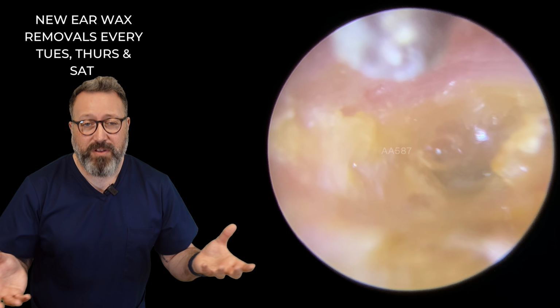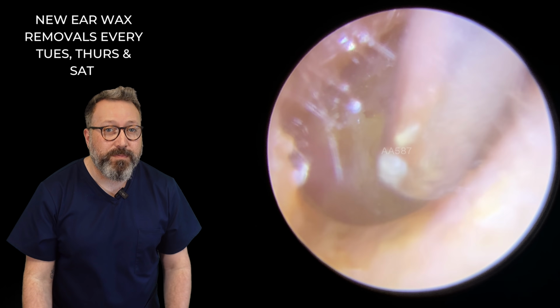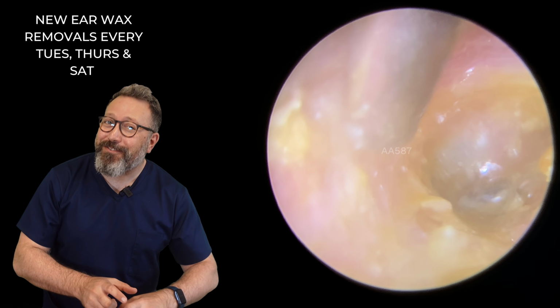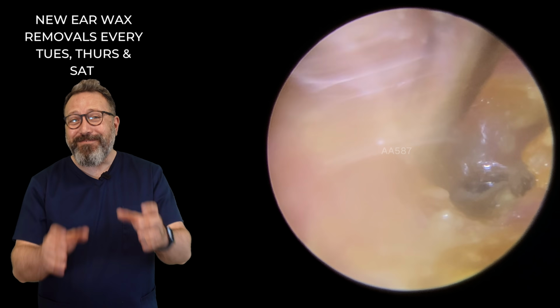So you can see now I've popped a little bit of olive oil in here. No, I've actually flooded it rather than putting a little bit of olive oil in there. Oh my goodness me, let me put my teeth in. Okay. I can't talk today, I'm so sorry guys.